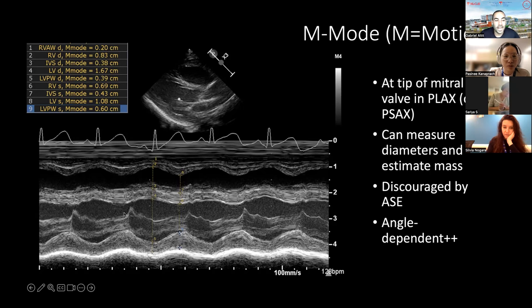Okay. And so that's why you have the E and then eventually the A, and the distance from the septum to the tip of this valve during early ventricular diastole is called the E point septal separation. We don't use it much in neonatal and in TNE, but I think it's important as you embark, you know these kinds of concepts because someone may ask you what it is.